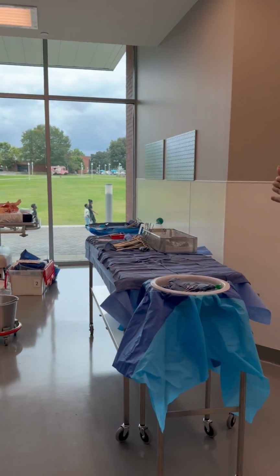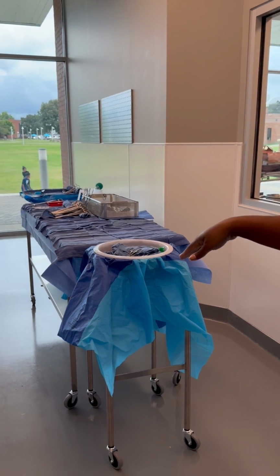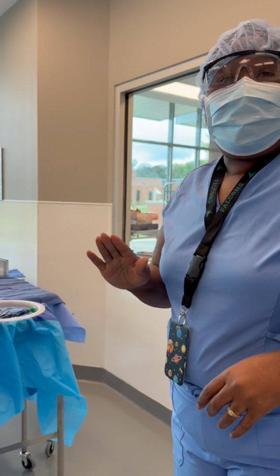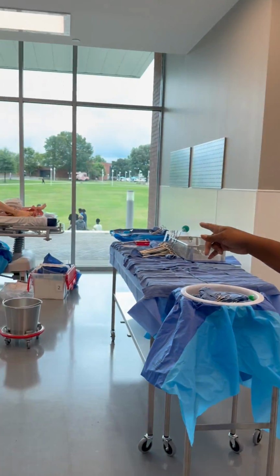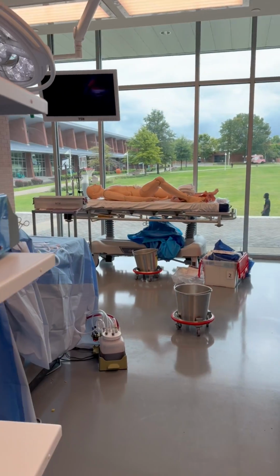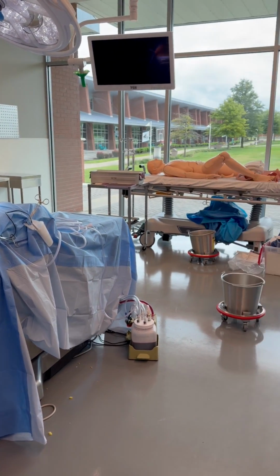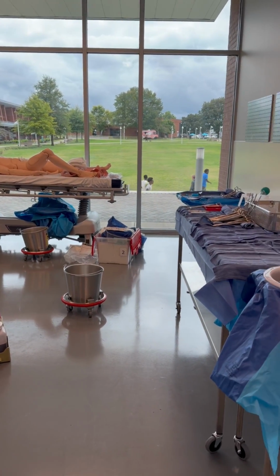We have our back table, our Mayo stand, and our basin, which are all sterile. You cannot go in between sterile fields. The patient is draped and sterile. You will not go in between, as that would be contamination.